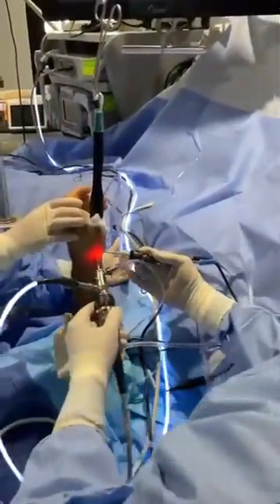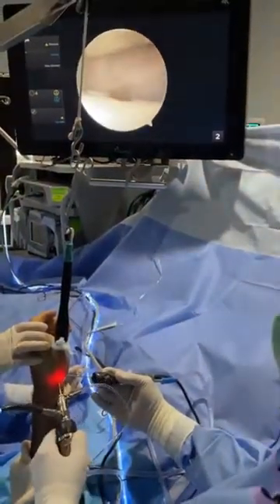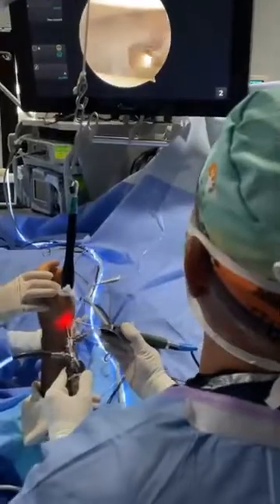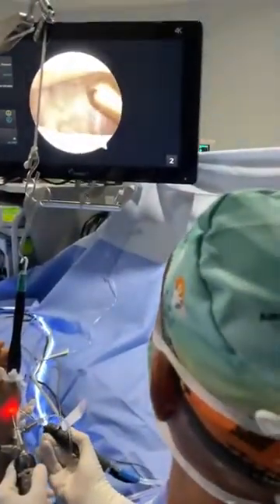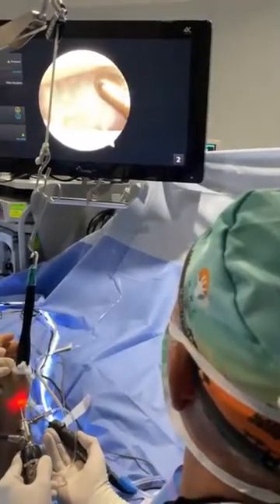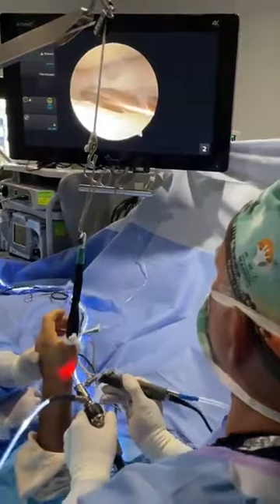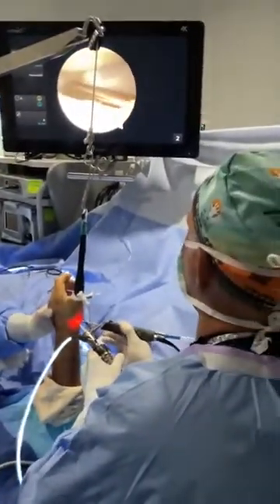It's a 30-degree camera, so if I want to look the other way I'll swivel the light source. Every time I apply suction, you see how that moves — those ligaments are too loose. Basically what he had is when he had the injury, he had a partial tear of these ligaments. Just think about a bad ankle sprain.